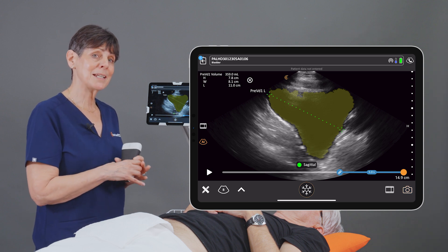So there you have it, a quick and easy way to get a bladder volume using your Clarius scanner. Thank you.